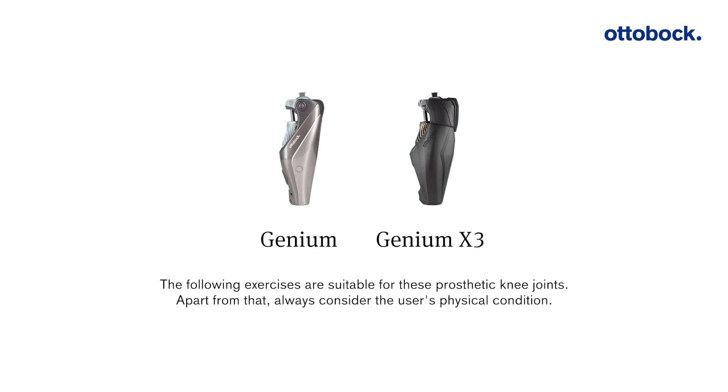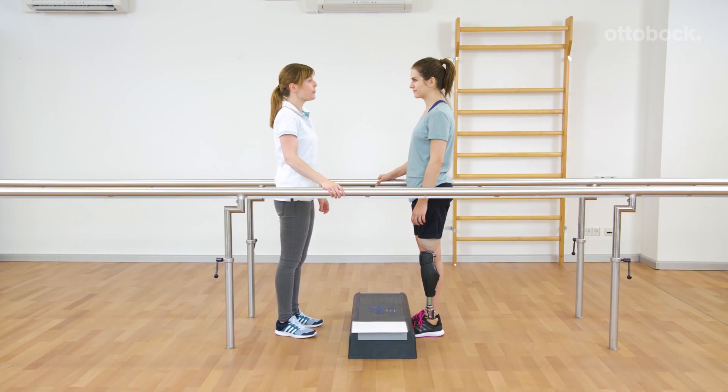The following exercises are suitable for these prosthetic knee joints. Apart from that, always consider the user's physical condition. Thanks to Genium and Genium X3, the user is able to walk upstairs step over step.